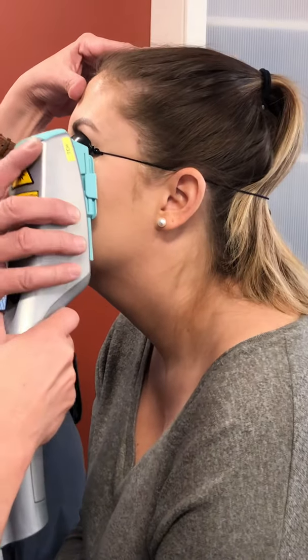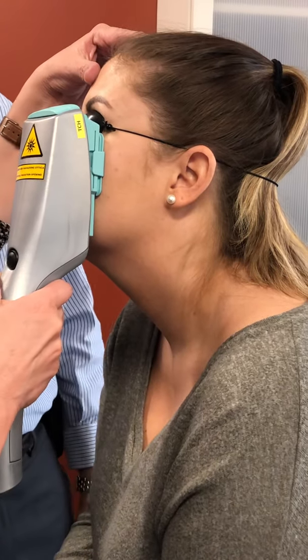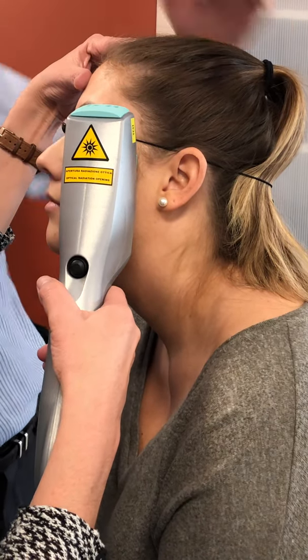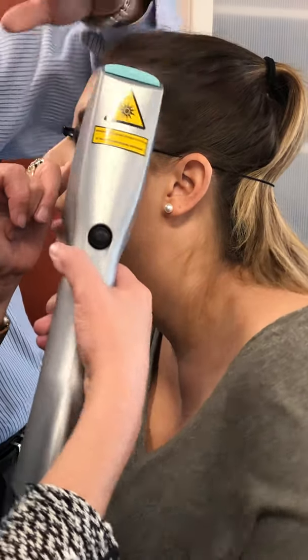2, come up a little bit more. Did I go too far? Because look at where your crystal is. The top of the crystal, I want the top of that crystal right there. Okay? 2, and then over here, 3. And then where's the 4? Then you're going to come up. Where do I want to hit that side? 4. What do I want to hit under here? It won't hit my hair.